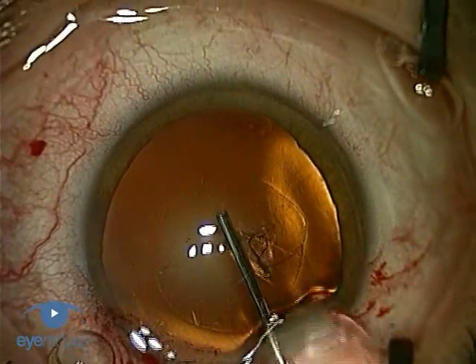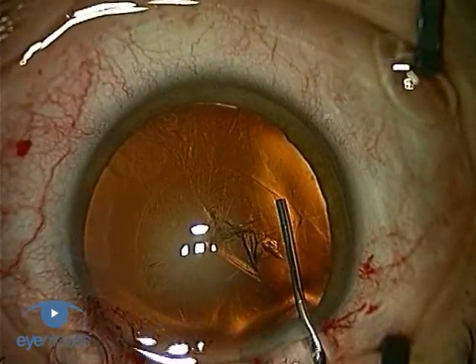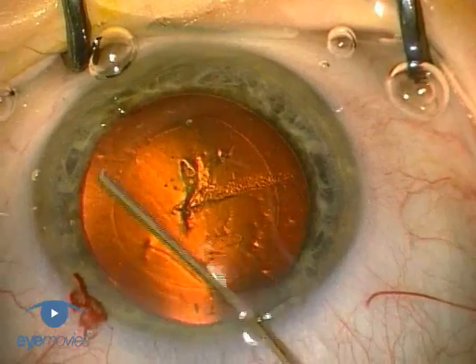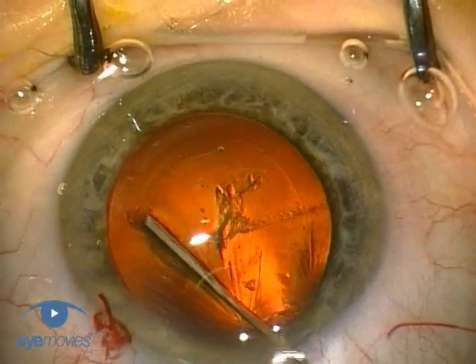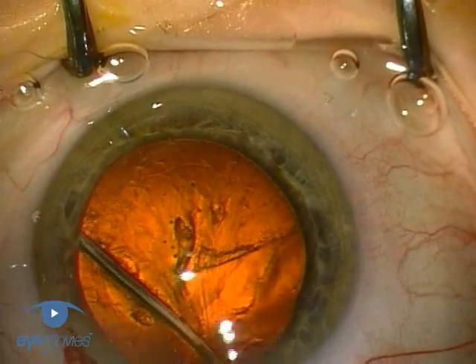Many surgeons like to begin by displacing the viscoelastic out of the chamber before making any attempt at either of the hydro manoeuvres. It's not essential to do this, but it may allow easier flow of fluid around the lens by reducing the outflow resistance as the fluid comes back out of the bag.